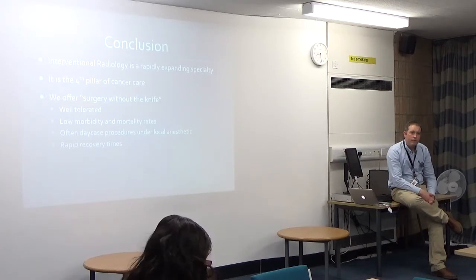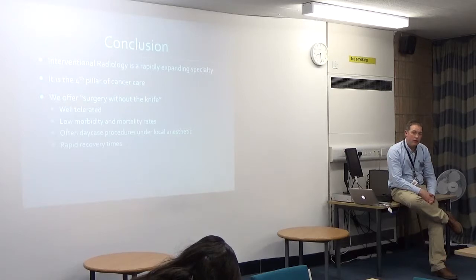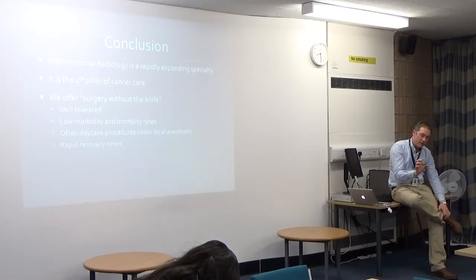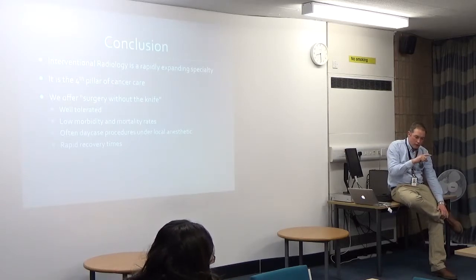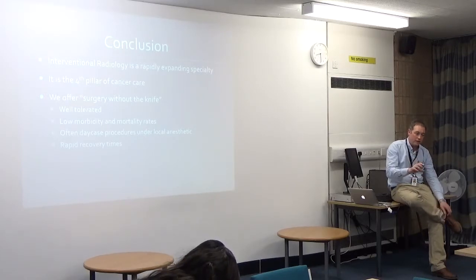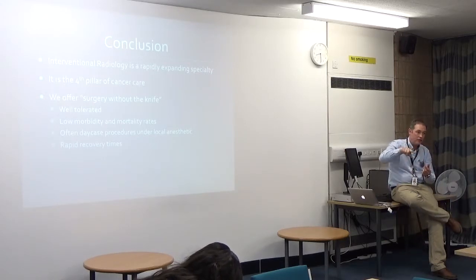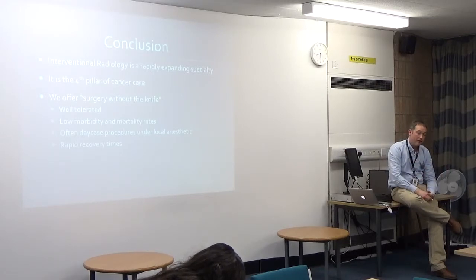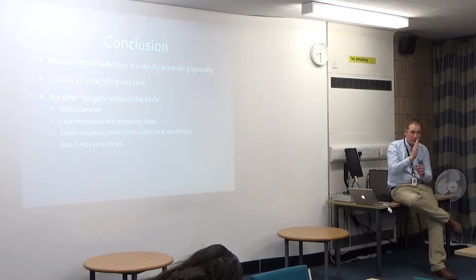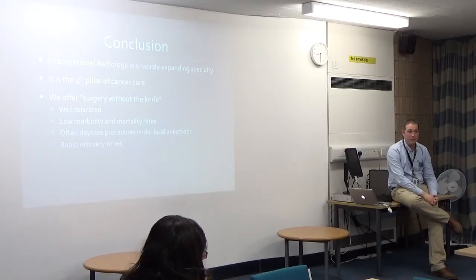What complications are there from the electricity? Well, you don't get much heating from it, so you don't get any thermal burning, which is its selling point, really. But because there's that large discharge of electricity, even though it's only for a very short period of time, there's small risks of changing your heart rhythm and that sort of thing. So they're very careful that each shock is timed with the ECG, the heart wave, so it doesn't cause a problem. Although we have seen a couple of patients who've changed their heart rhythm briefly and gone back to that heart rhythm at the end, not a dangerous heart rhythm, which can limit the treatment that we can offer. But we call it gated, so each little shock is timed with the heart rhythm for maximum safety.